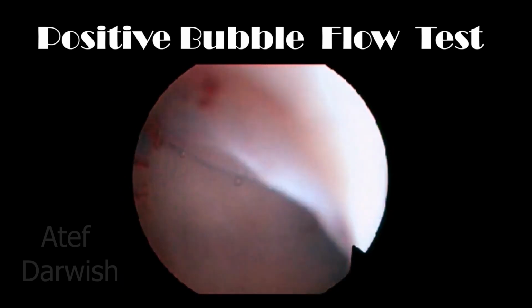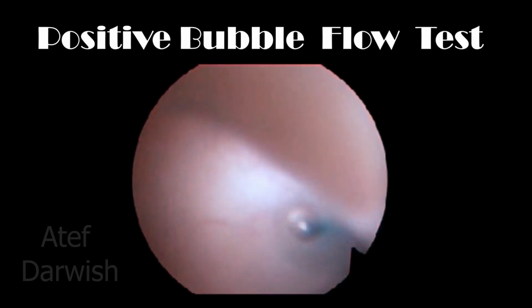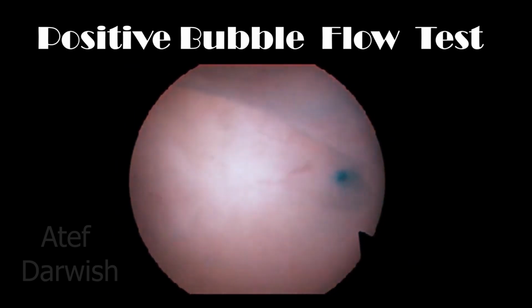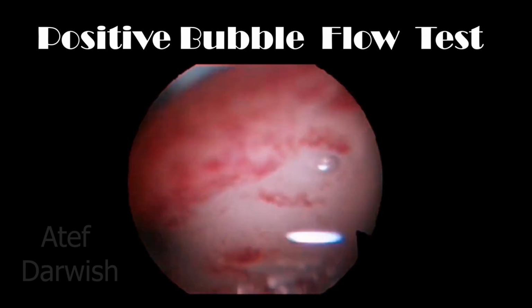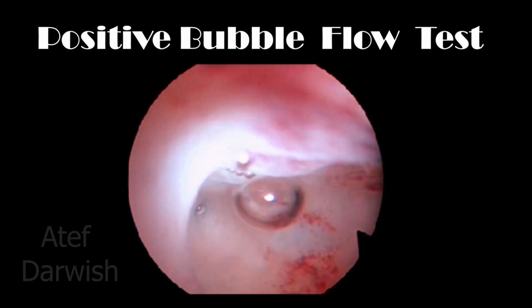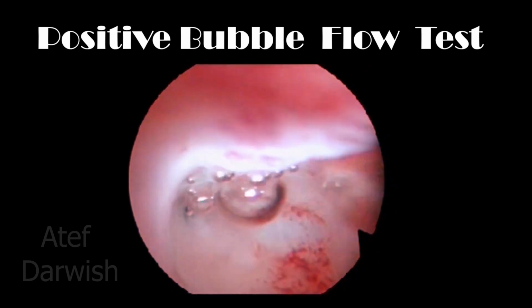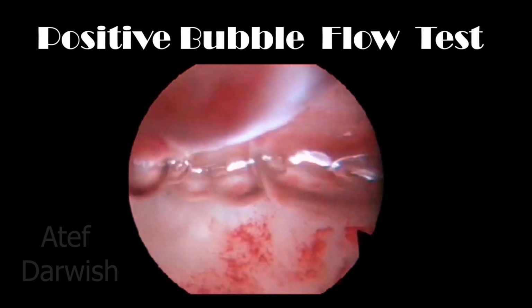Actually, a positive bubble flow test is an anatomic patency test, which means that the isthmic or proximal part of the fallopian tube is anatomically patent, but it may not be functionally working as usual, because the fallopian tube is not just a simple tube, it is a paired dynamic organ.